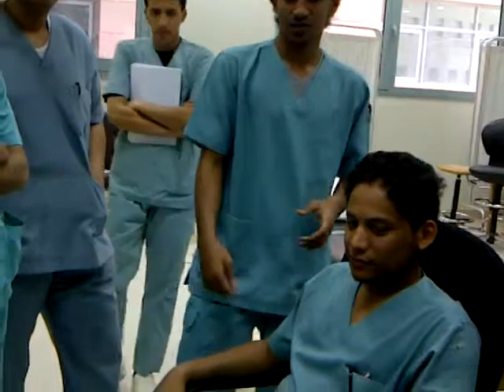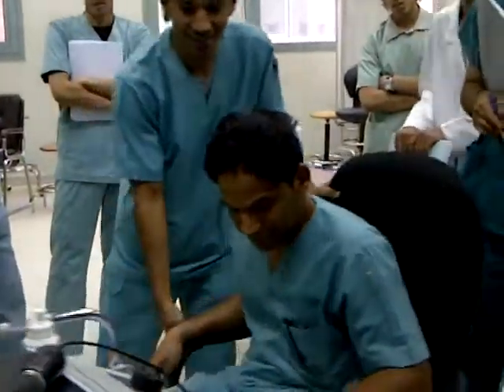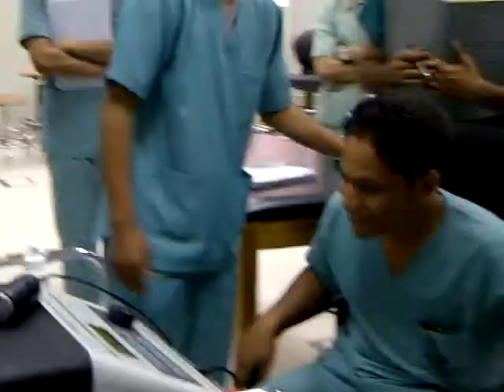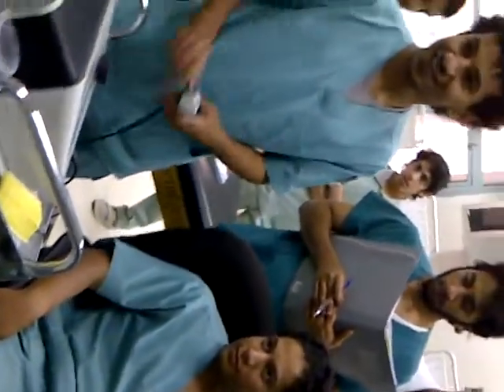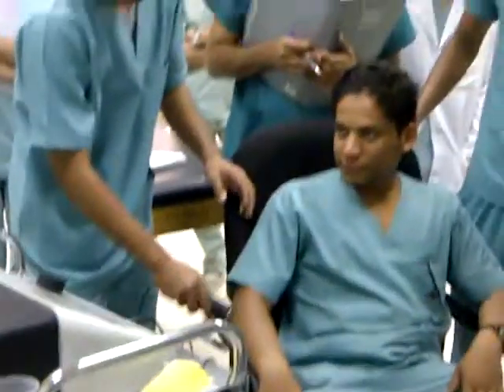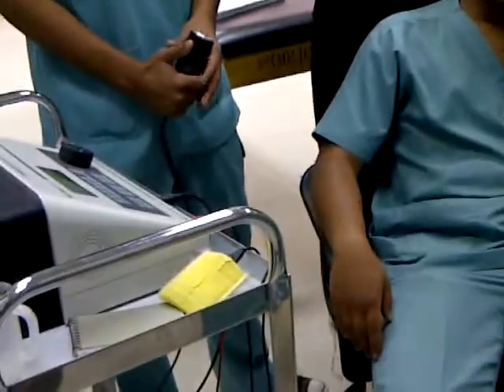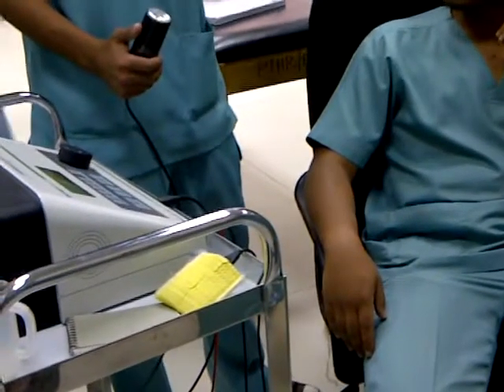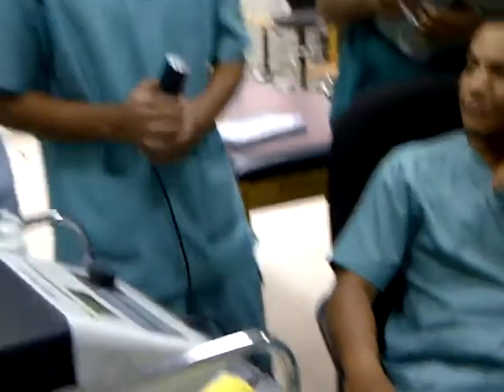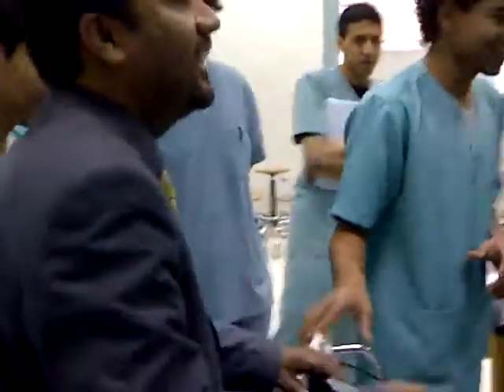How will you treat? Position properly. Where you want to make a change, make the change. Do it. Is it right, or are you making any mistake? No, I have not. Why? I should take a chair. Exactly, take a chair, do not stand and do it.